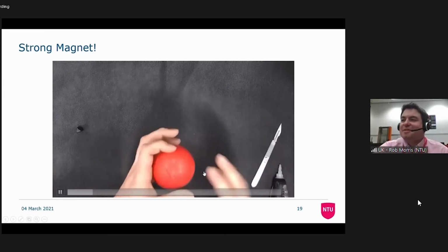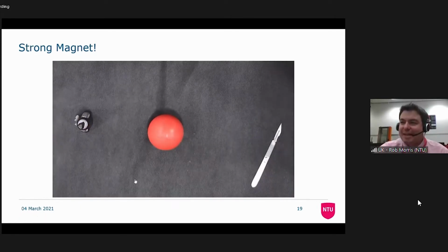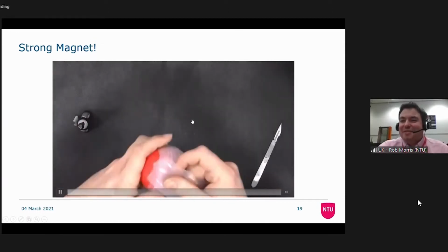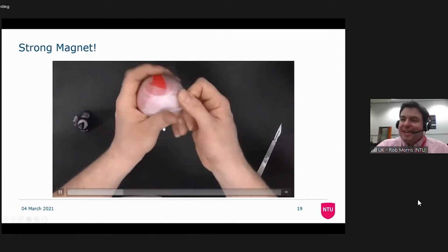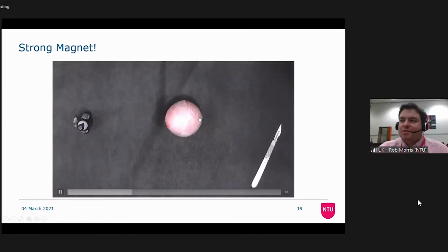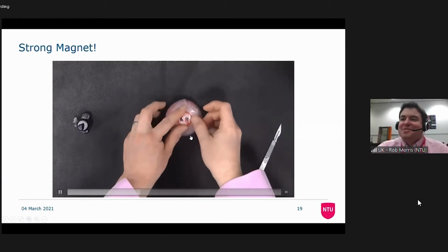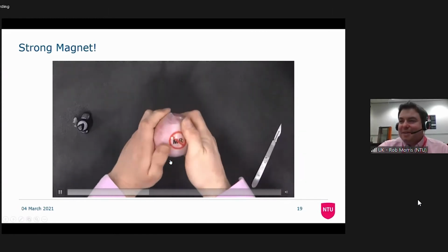So this hopefully makes it nice and safe so that we can chuck it in and see how strong the magnet is. I was then a bit worried that it might pop out, so I wrapped it in Clingfilm too, with the hope that it would stay in there for its next little journey. The washer itself is not particularly magnetic, it's just a steel washer, and there's an MR unsafe sticker just to make sure that no one has any problems with it in the future. Then we'll take it over to the scanner to have a look.